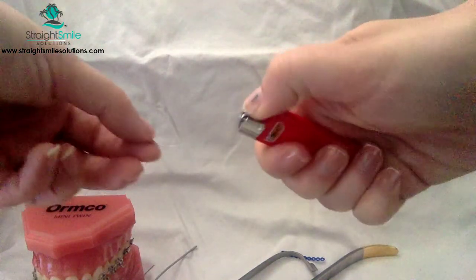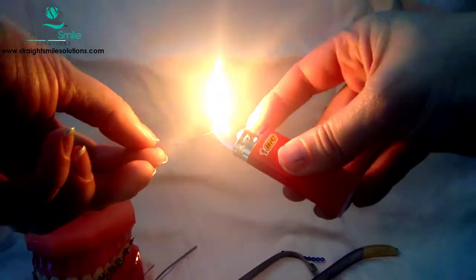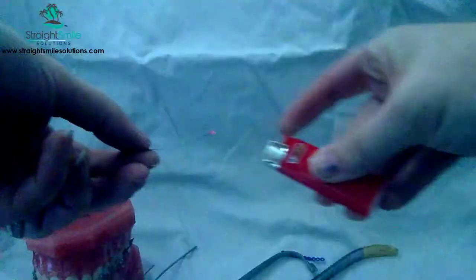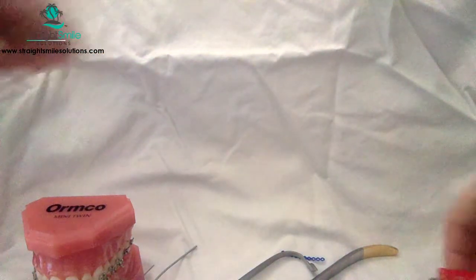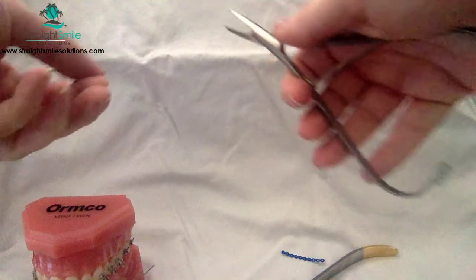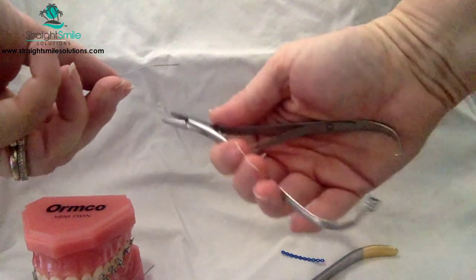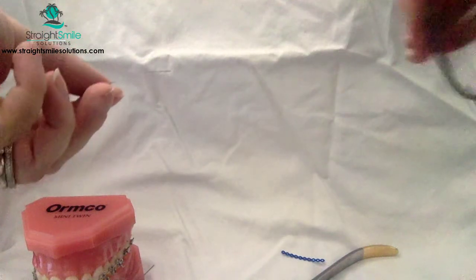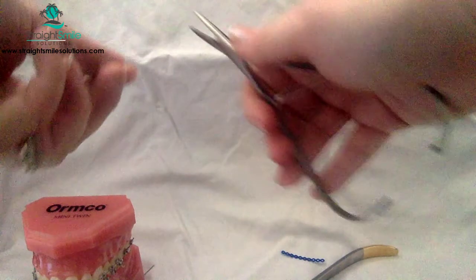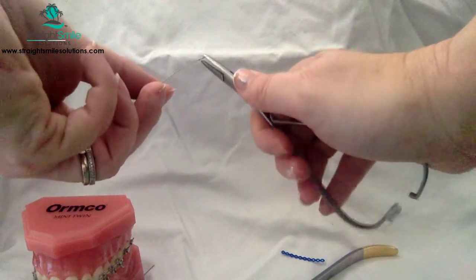Then we're going to go ahead and flame it on the blue spot until you see it glow red. Then let it cool down, and then you're going to cinch back, or cinch in, going distal and palatal or distal and lingual. So, as it goes in the patient's mouth, you're going to make a right angle with your cinch.